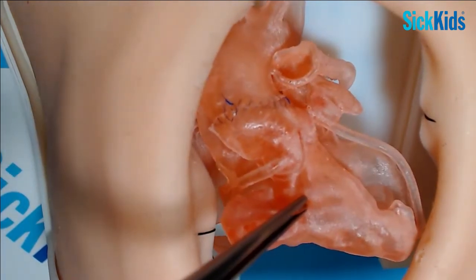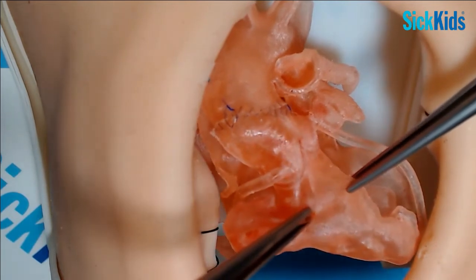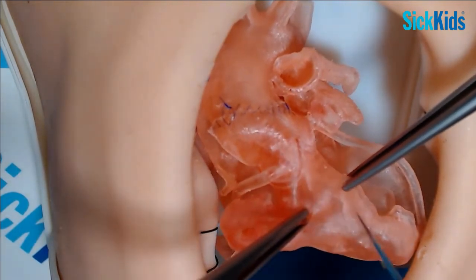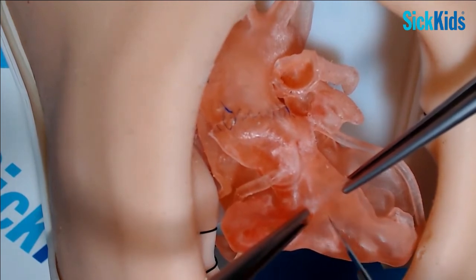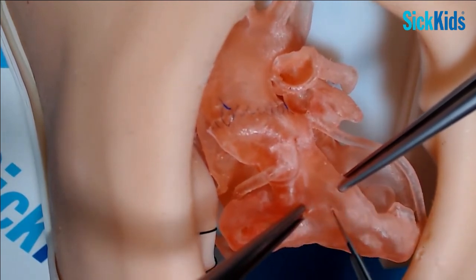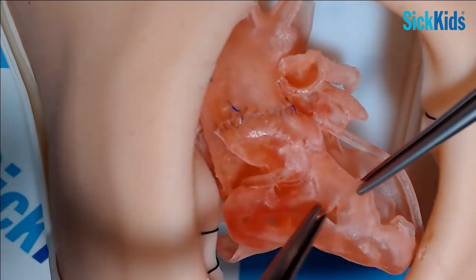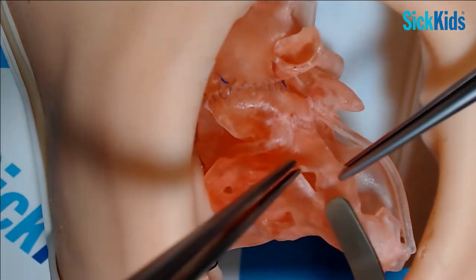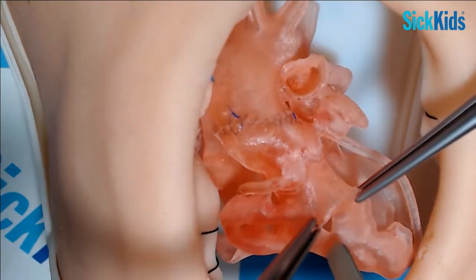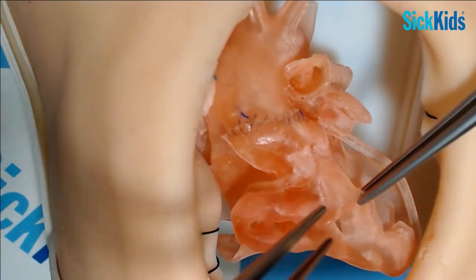So I think the first thing you do is start lower than you think you need to. I know we can see the truncal valve, but I'm going to start at what I think is the lower end of my ventriculotomy to get into the right ventricle. And then once you've made a way in, then you can look inside. Yeah, and you just have a good look around and make sure you can look up and see where the truncal valve is, and then know that you're safe to come a bit further north.